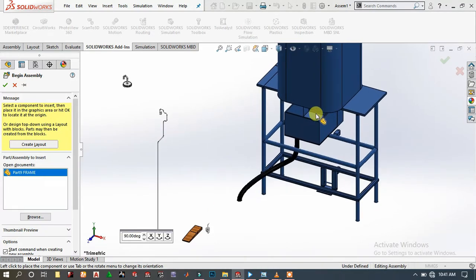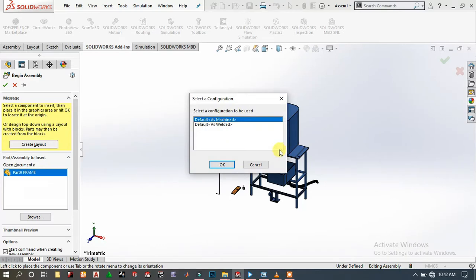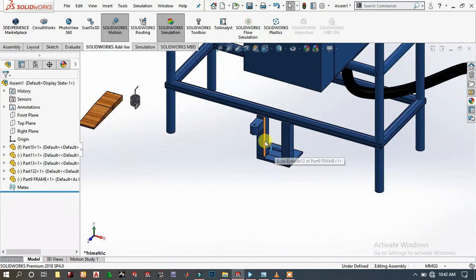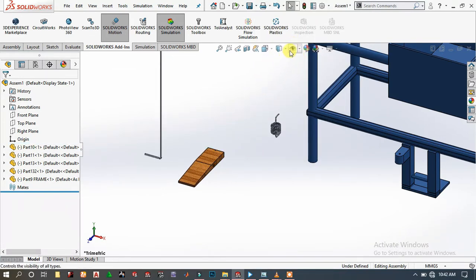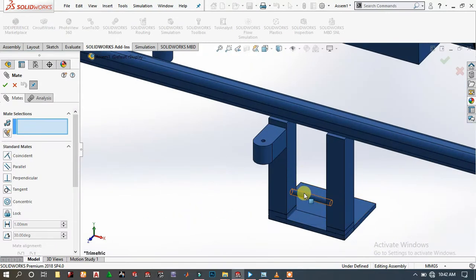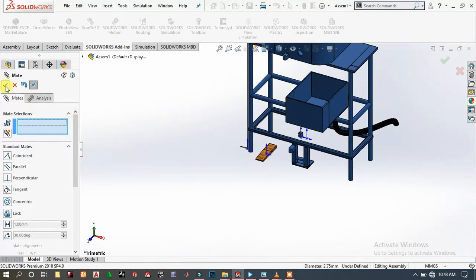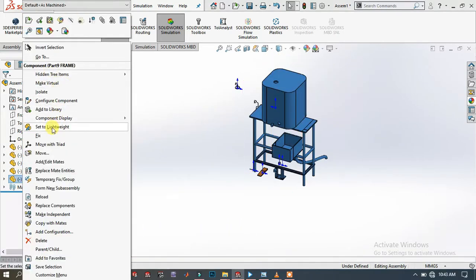We have to flip this direction in the Y direction, rotate it, then place it here. Click OK. Make it float, then we can easily drag it around there. Then choose this face and this face, concentric mate. We have to fix this part. Right click on this part and click fix.